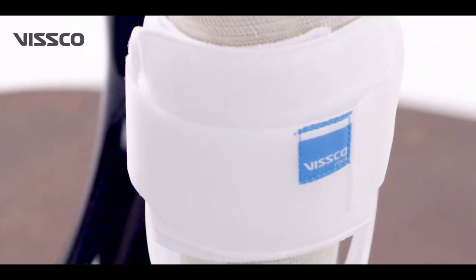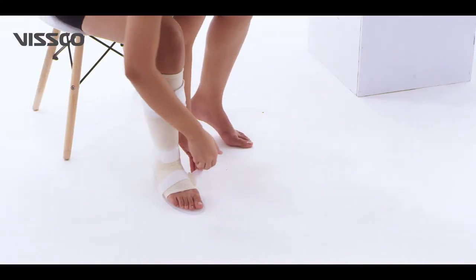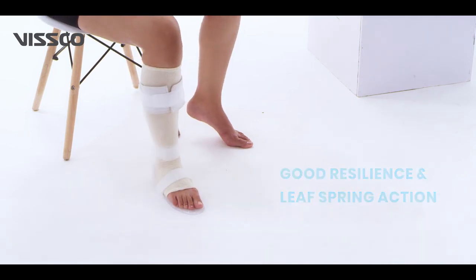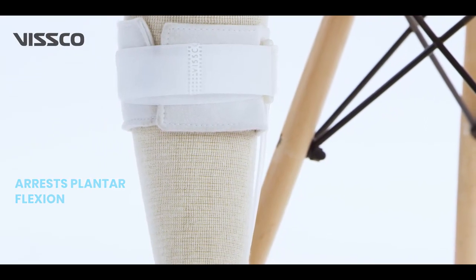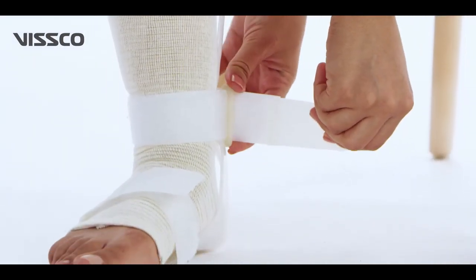Vissco foot drop splint is light in weight and made of polypropylene material. It has good resilience and a leaf spring action. The foot drop splint arrests plantar flexion and keeps the foot in a functional dorsiflexion position.